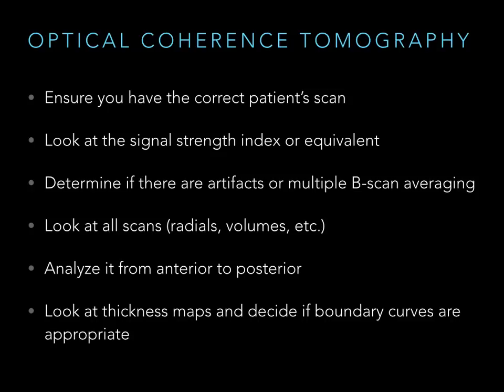Here's a couple of tips when you're looking at OCTs. I'm going to read off of these. Make sure you have the right person. It's happened to me. It'll happen to you. Look at the signal strength index or equivalent. Not as big of a deal as spectral domain with some of the other ones, the older ones. That was a really big deal.